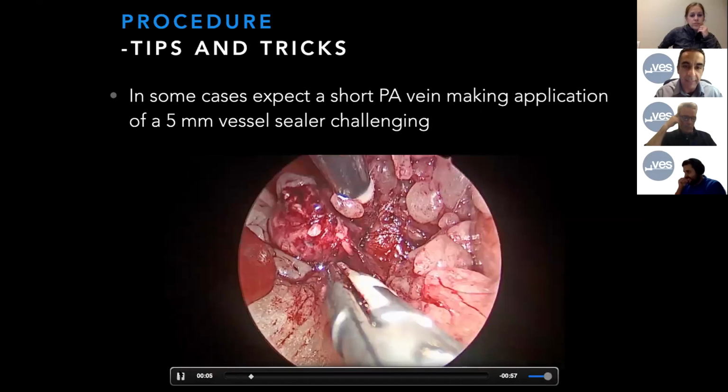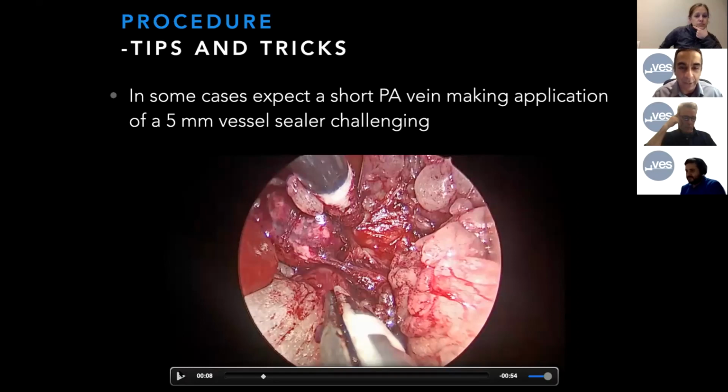I'm just going to pause the video. At this point, I'm in a bit of a conundrum because I would love to have a 3 millimeter vessel sealer device. I was really lucky, a few years ago I had Dr. Giuliani Quizzan come to visit us, and she did some great work on a 3 millimeter vessel sealer, which would be perfect in a scenario like this, where there's maybe 5-6 millimeters of phrenico-abdominal vein available to get sealed. It's a sealer that's made by a company called Boulder Surgical now. I don't know if they're in the veterinary market yet.